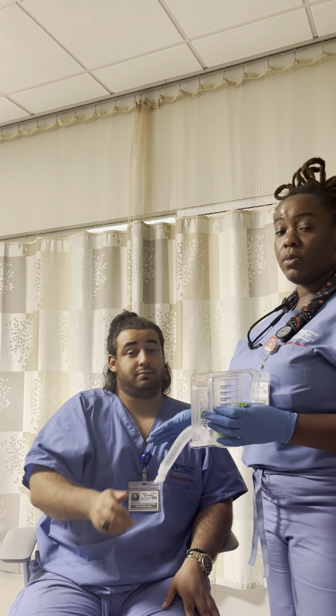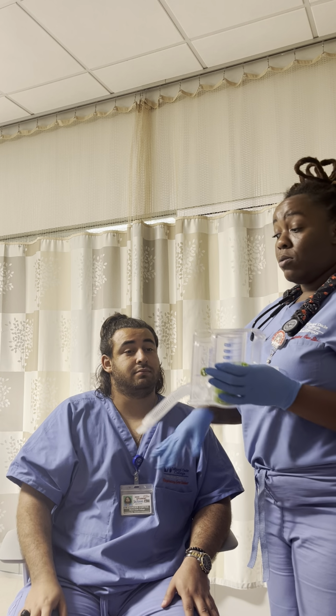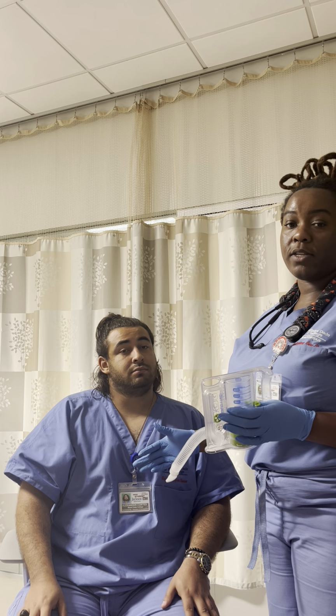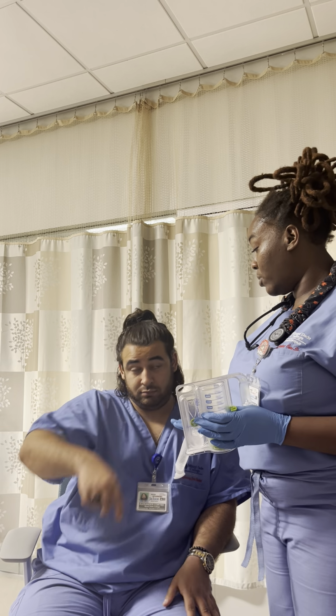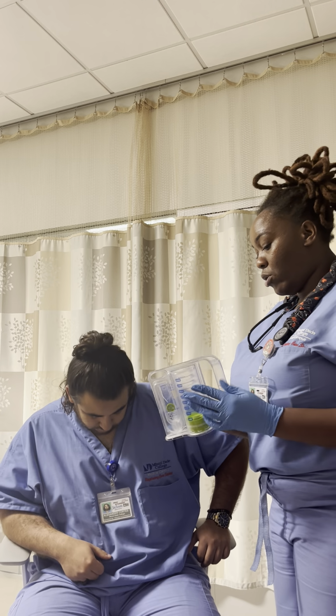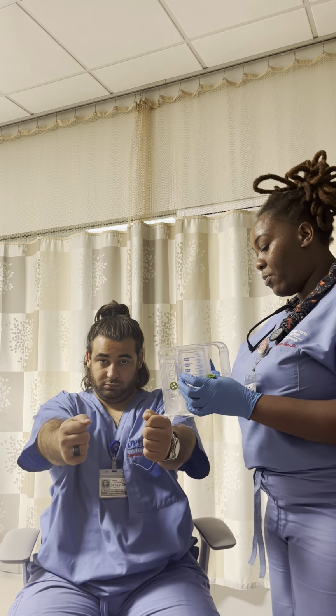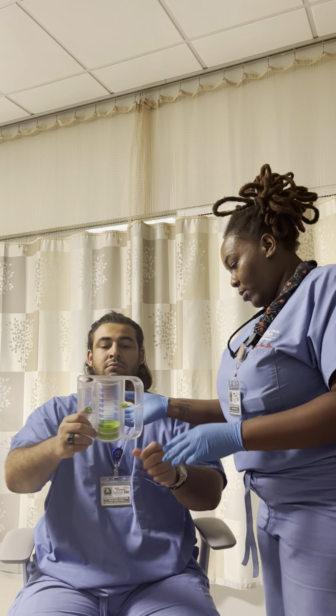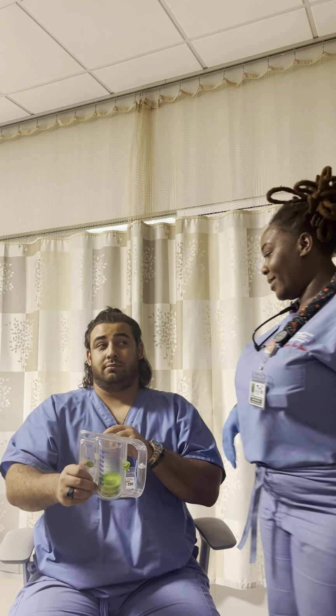And also important that this patient has to be sitting up when performing IS or in a semi-Fowler's position, okay? So you must be sitting up all the time. You can either sit this on the table or you could hold it upright in your hand, okay? So, seems like you've done this before.